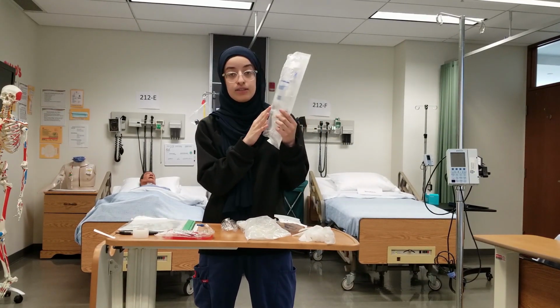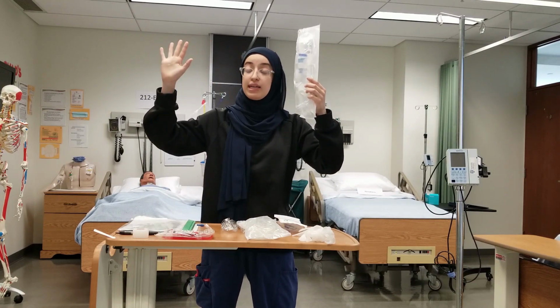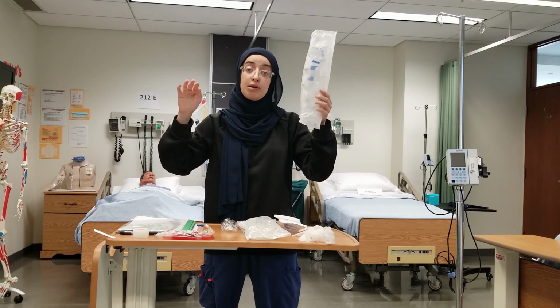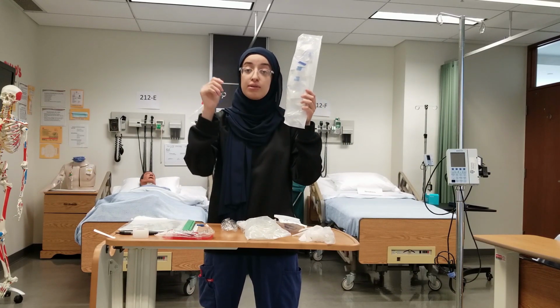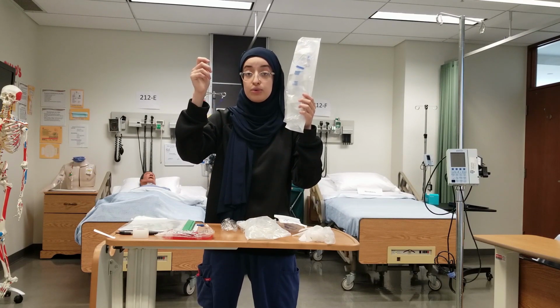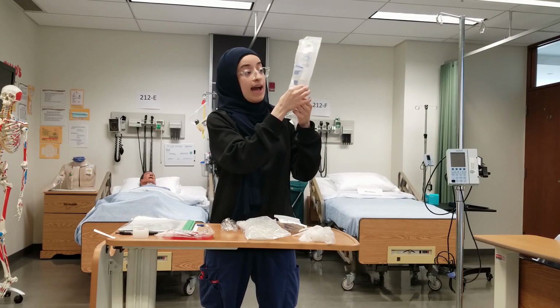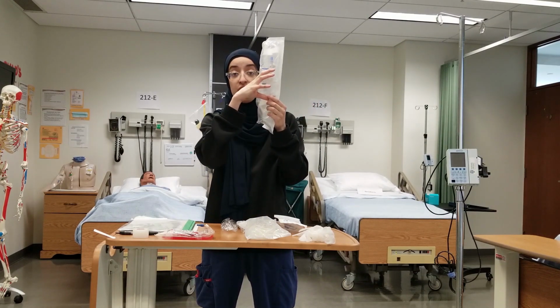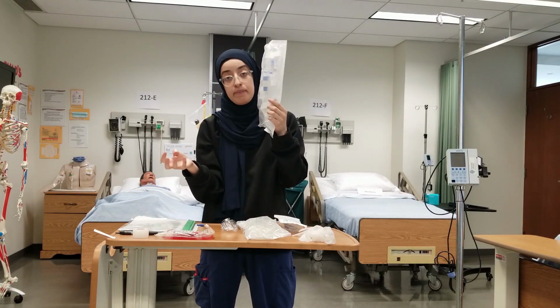What's very unique about this type of tubing is it's got two different ports that'll branch off. One will connect to our normal saline, one will connect to our blood product. The clamps actually work differently for these ones. So instead of pulling them down to close the tubing, you're actually going to push them up, and we'll show you that in a second. And then it has a filter in the drip chamber. And the reason why we have the filter is to filter that blood product before it reaches the patient.